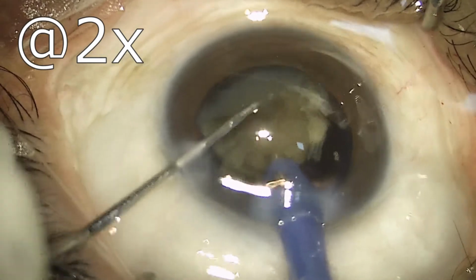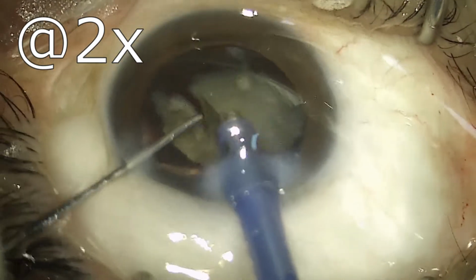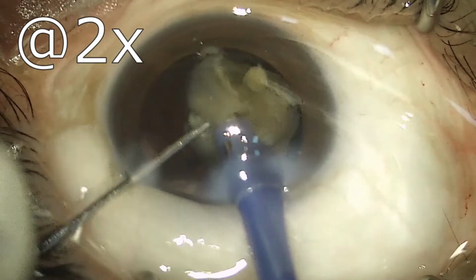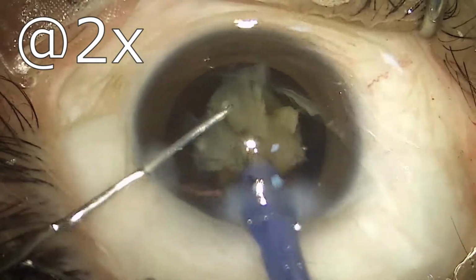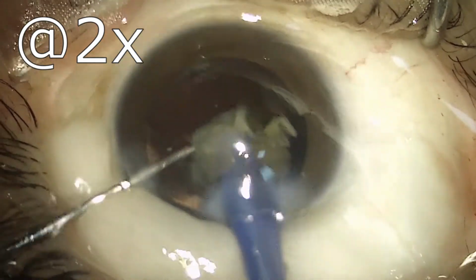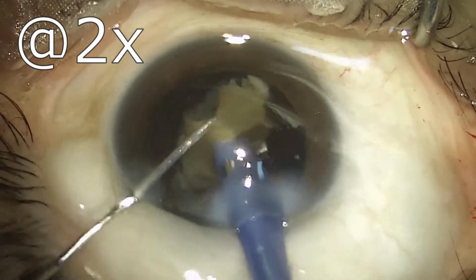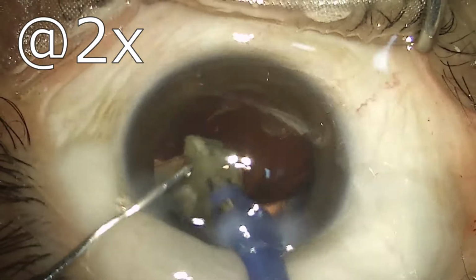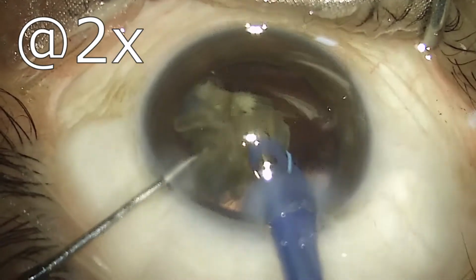Now the last quadrant is being emulsified, and at this moment it's important to reduce the aspiration flow and vacuum. If you keep your settings at linear, then lifting the foot pedal a little bit will help in removing this last fragment, which may otherwise cause sudden collapse of the chamber, and the bare PC may come into contact with the phaco tip, causing a PC tear.